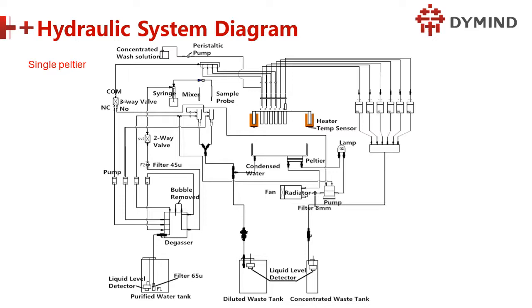We have 4 inlets of pure water, and we can clean four cuvettes at the same time. After that, we have the pump to pump the extra water out of this chamber. So you can see the diluent in and also the waste out, both of them at the bottom. This system we call the cleaning system or cleaning station, cleaning and drainage, but the drainage is from the top. So this principle is different from our previous hematology analyzer, right?